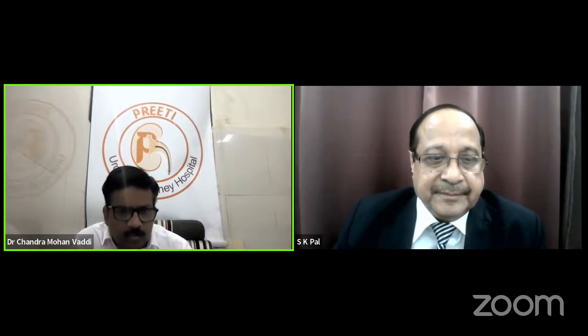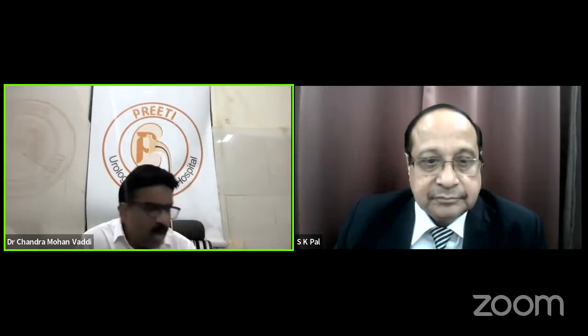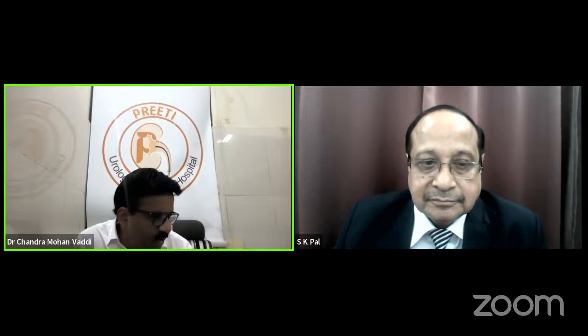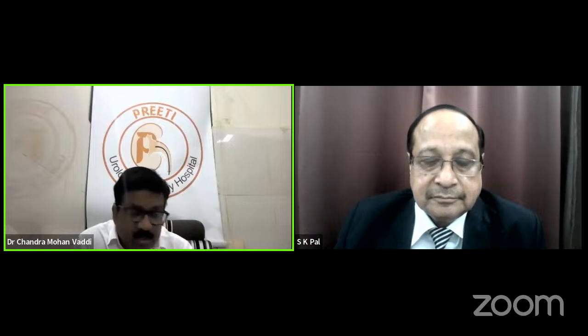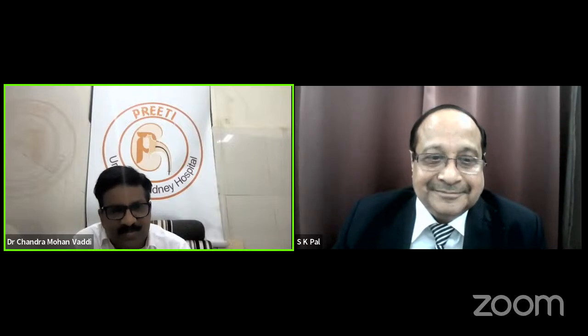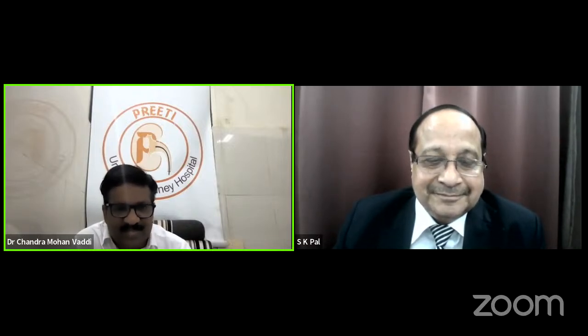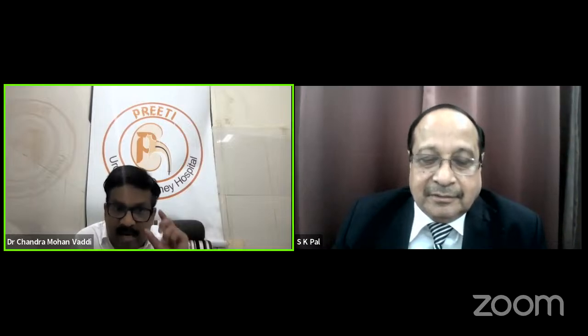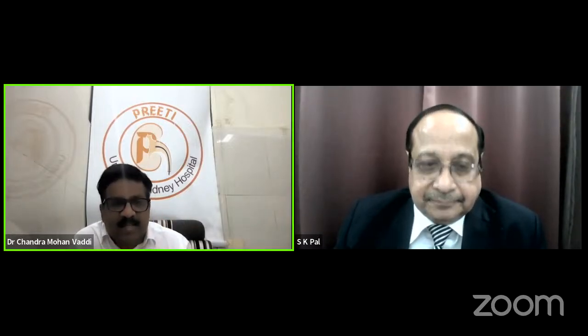Yes, sir. Sir, one question from the audience. It's a good question. Wasif Ashraf asks, does the Hounsfield unit of the stone have anything to do with the size of the tract if you don't have laser available with you? See, even when the laser was not available, we were breaking all stones with lithoclast. It is not that the laser is a must. He's asking, does a hard stone require a larger size tract?